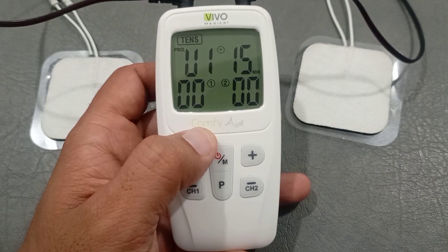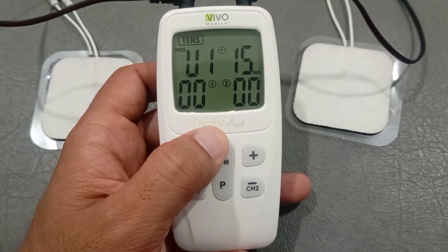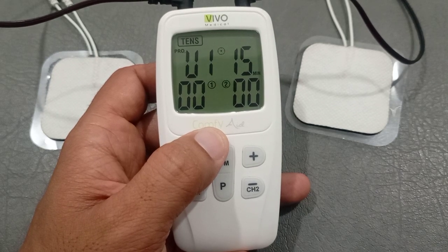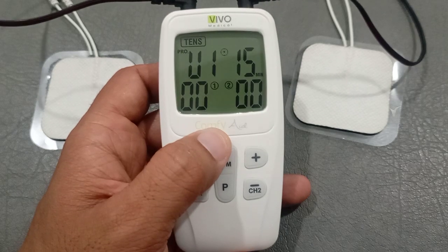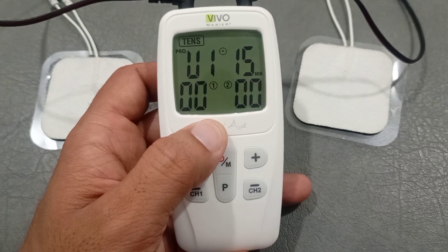In the low frequency mode, the frequency is less than 50 Hz or 50 pulses per second, and the intensity is maximum tolerable or maximum bearable. Lastly, we have acupuncture TENS in which the frequency is less than 3 Hz, ranging from 0.4 to 3 or 5 Hz only. And there are different devices available that can be used for acupuncture TENS as well.